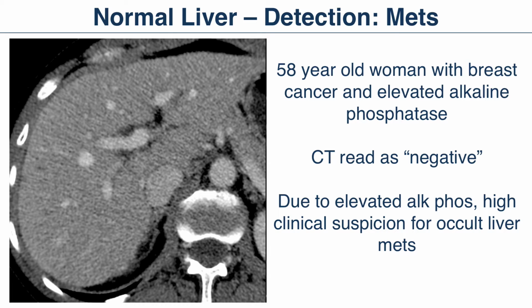Rhetorical question. You might argue, well, maybe over here, I don't know. Read as negative. So they called me and Cynthia Santillan, and we said, well, why don't you consider a Gadoxetate MRI?